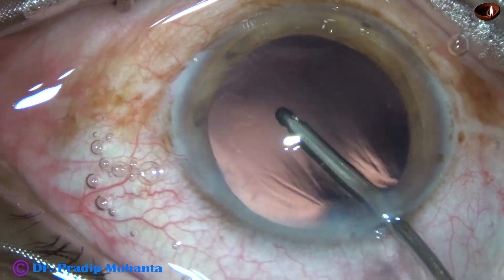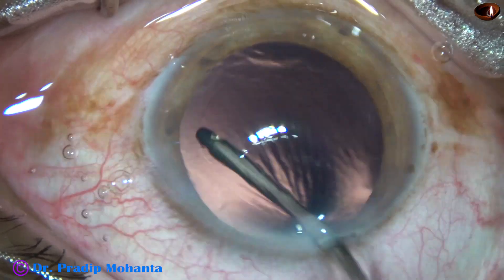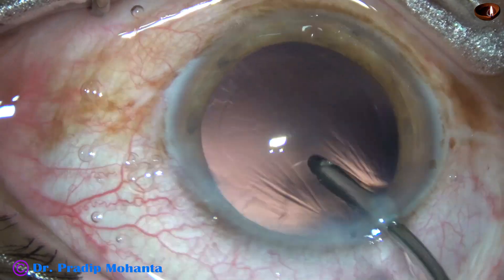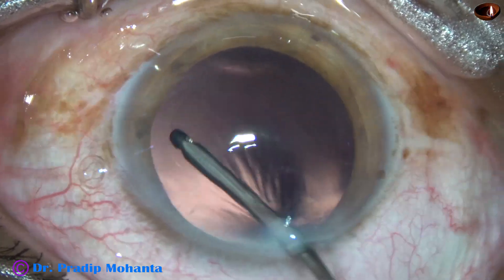This is hydropolish. The irrigating probe is being used to polish the posterior capsule. The fluid jet dislodges any cells on the posterior capsule.